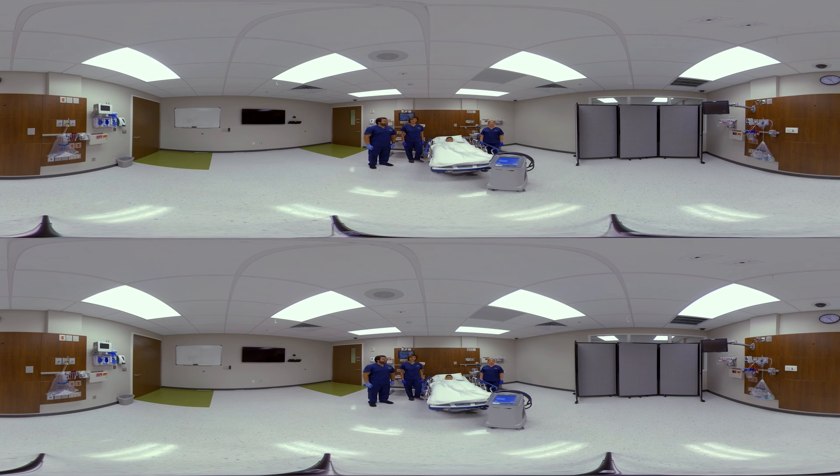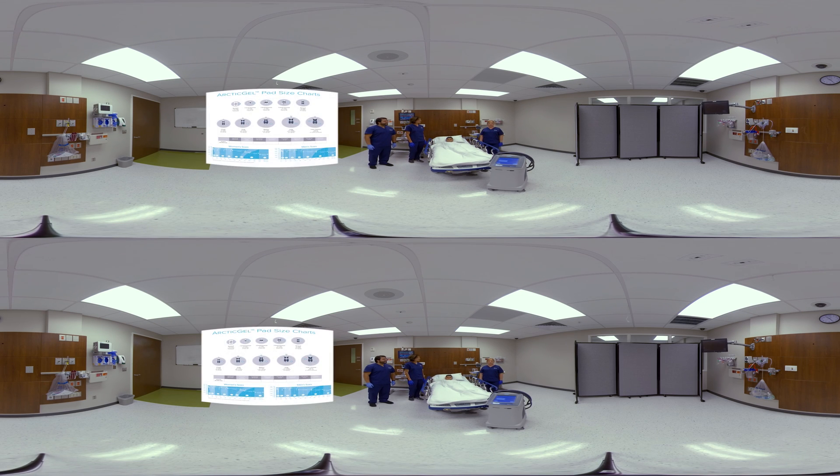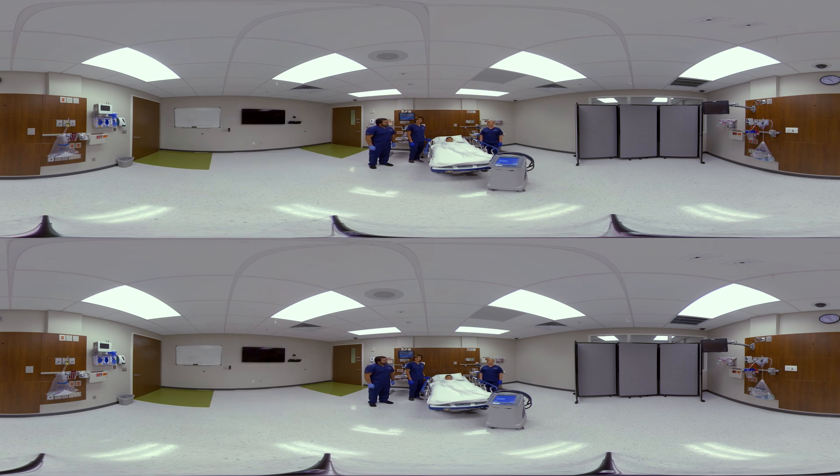When treating a pediatric patient on the Arctic Sun 5000, pad sizing is incredibly important. You can use the size guide that's hanging from your device. For Cruz, our pediatric patient, we can either use small universal pads or a set of extra extra small pads. We'll demonstrate the use of small universal pads. They come in a package labeled 'small universal' and include one gel pad and velcro straps. The small universal pad comes with the cloth liner attached to it, which you can place directly on your patient and secure with the velcro straps.